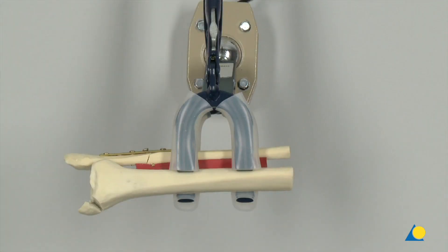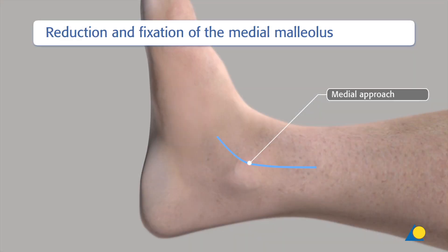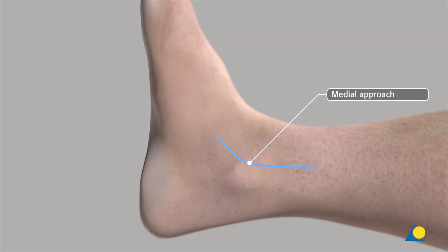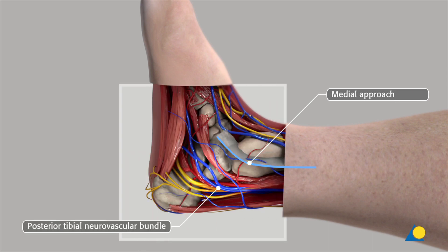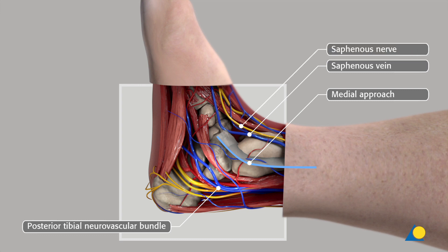The next step is the reduction and fixation of the medial maleolus. On the medial side, a medial approach is used through an anteriorly curved medial incision on the medial maleolus. The posterior tibial neurovascular bundle must be respected. The surgeon should be aware that the great saphenous vein and the saphenous nerve lie anterior to the incision.